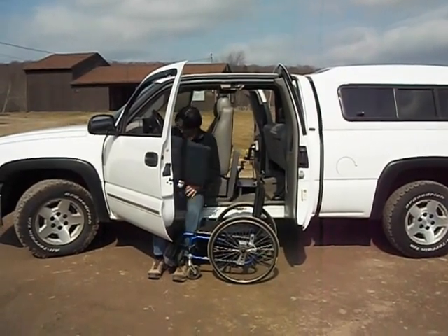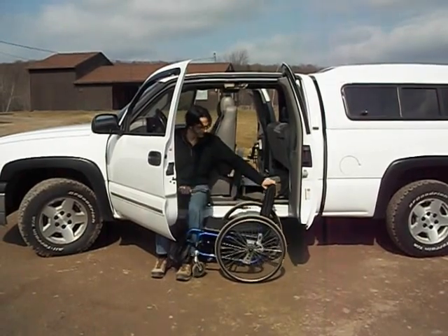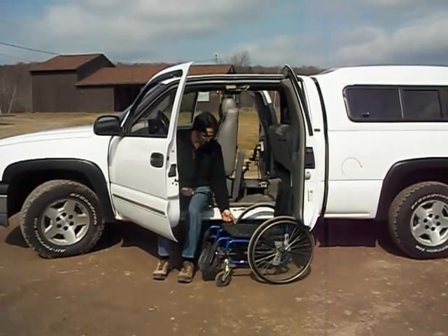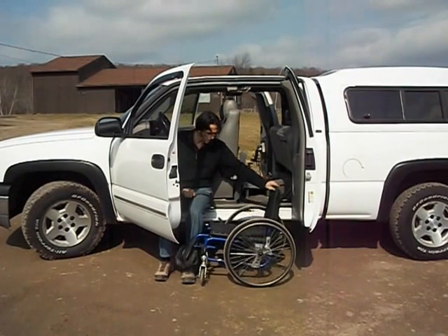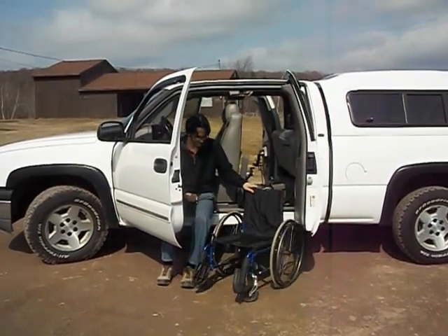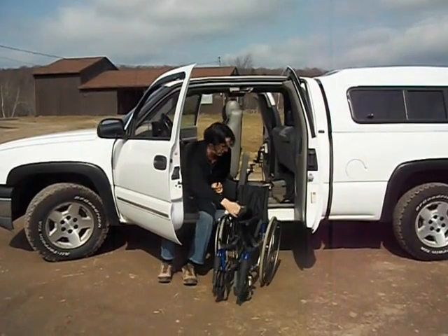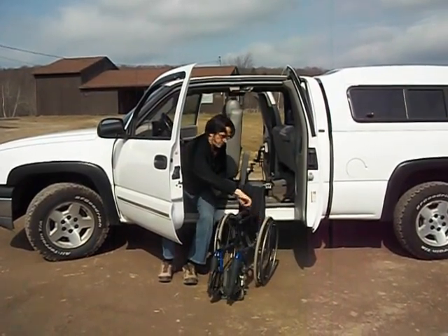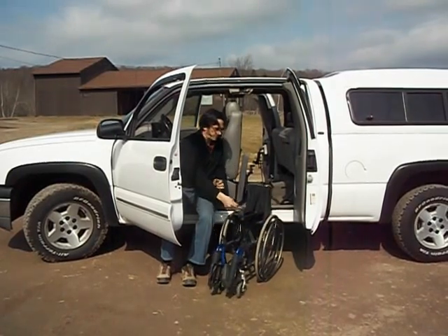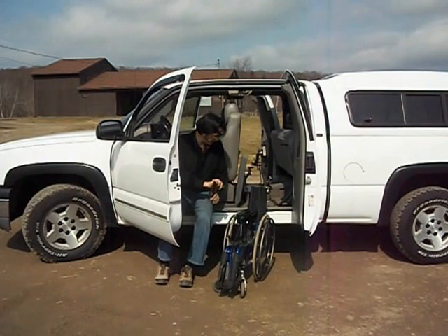At this point, we're going to take the wheelchair cushion and put it aside, then unlock the wheelchair. There's a Velcro strap which we'll typically put on the wheelchair to keep it from flopping.